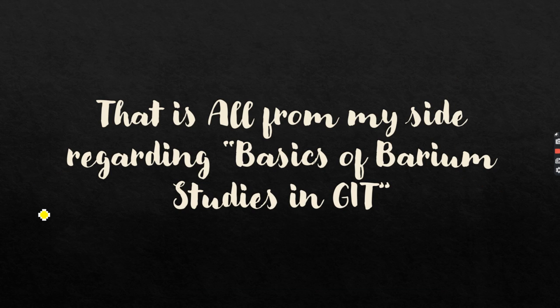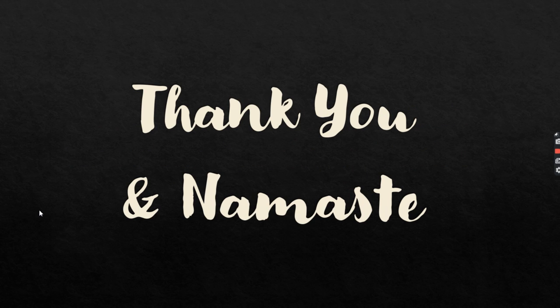So that is all from my side regarding the basics of barium studies in the GI tract. I know it's slightly lengthy, the fourth one, the final part, but it's okay. So these were the basic points covering the basics of barium studies in the GI tract.